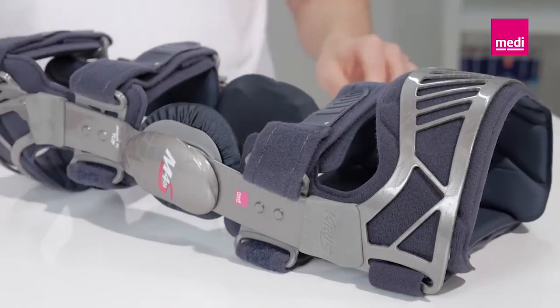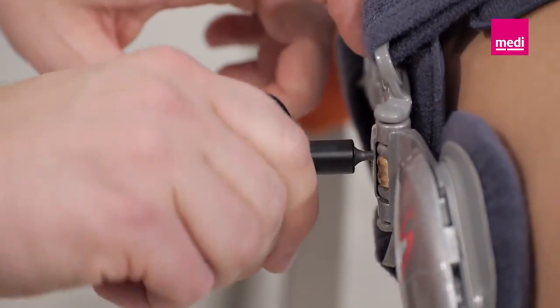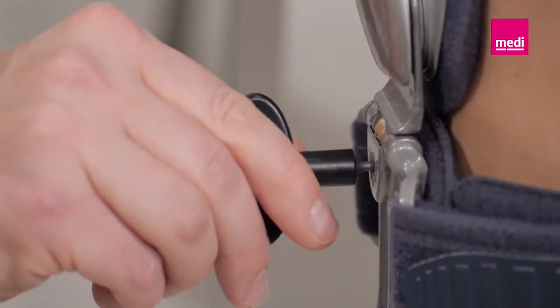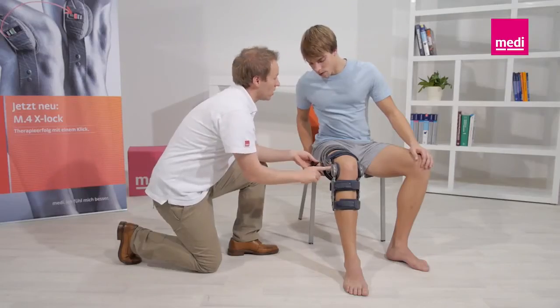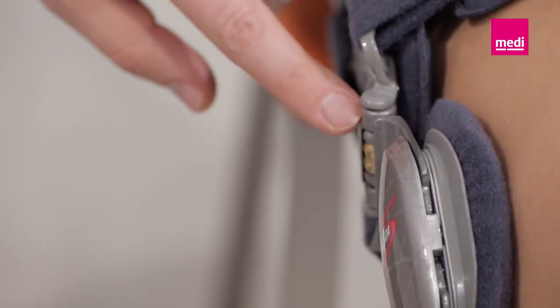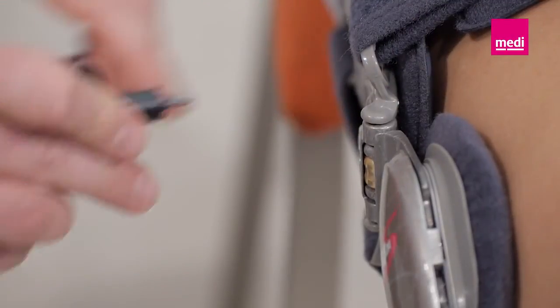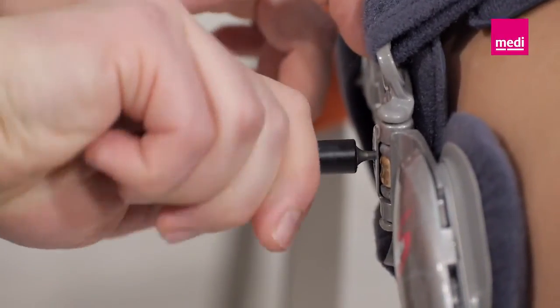The hinges above and below the knee joint can be set to reduce varus for bow leg deformities and reduce valgus in knock knee deformities, depending on the product variant. In this case, it is advisable to show the patient how to set this himself, in order to be able to adjust the orthosis to the treatment status at any time. With the patient sitting, set the varus/valgus hinges to the neutral position with the help of the Allen key. This has been achieved if the pad lies flat on the orthosis hinge but exerts no or only very gentle pressure at most.